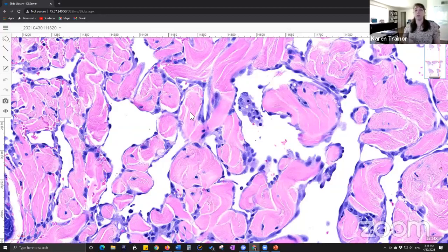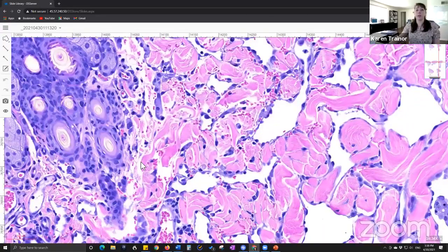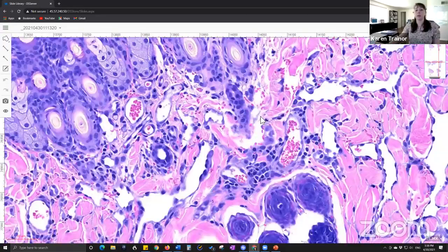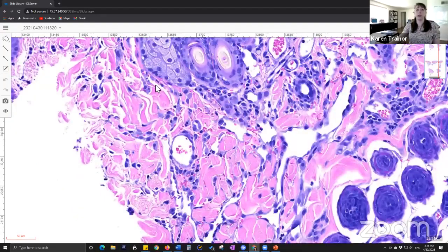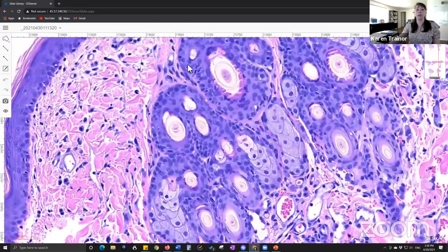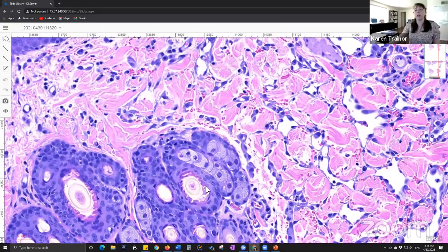So there are also immunohistochemistry stains. CD31 will light up these endothelial cells, but factor 8A is one that will light up blood vessels in particular, and LYVE-1 is one that is used to detect lymphatic endothelial cells.